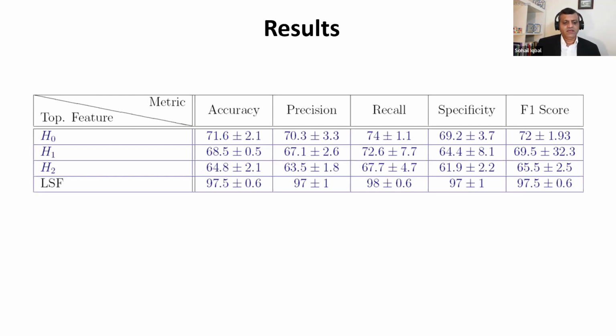We later tested on other data sets as well, and the interpretation is that the data set is not very advanced; for example, the disease is not at a very advanced stage in most of the images. As you can see, the consolidations which we planned H2 to detect were not so many in our images. So that's why, in this data set, H2 is not performing very well, but in general, if you consider only the images with consolidation, it performs very well. So the point is, it's a very well-balanced thing.